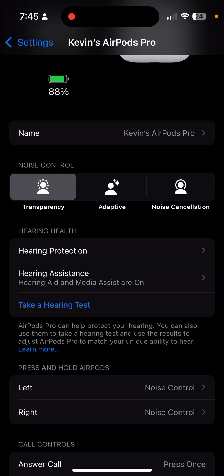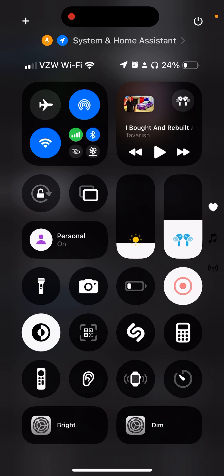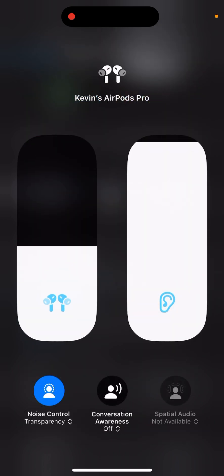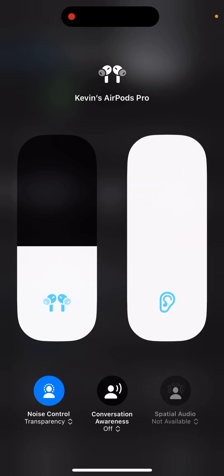First, swipe down from the top right to go to your Control Center, then find your volume. I have my AirPods in while recording, so you'll see they're selected. You'll want to have your AirPods in to access this menu too. When you force touch on the volume slider, you'll see your hearing aid option. Make sure the volume on your hearing aid isn't accidentally left all the way down, as they won't function — so make sure that's up.